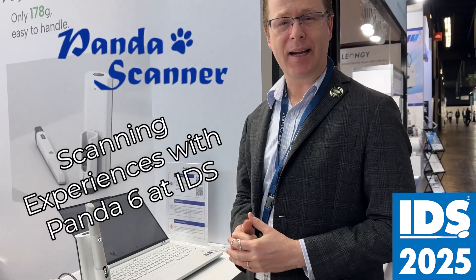Hey everybody, this is Dr. Michael Scheer here at the IDS in Cologne, Germany, taking a look at the latest generation of the Panda scanner, also known as the Panda 6. It comes as a wireless scanner. Let's go ahead and jump right in and take a look and see how it scans.